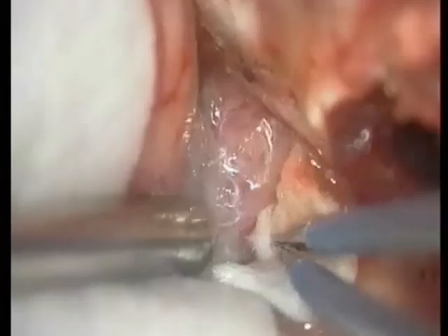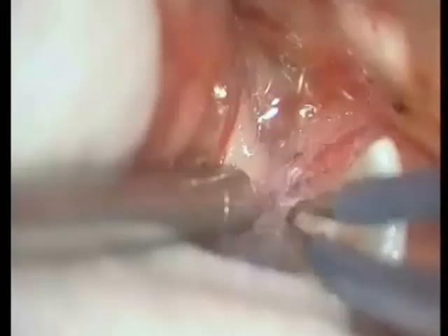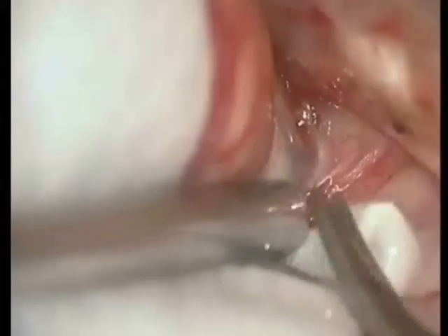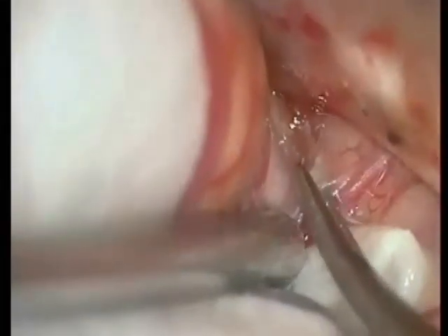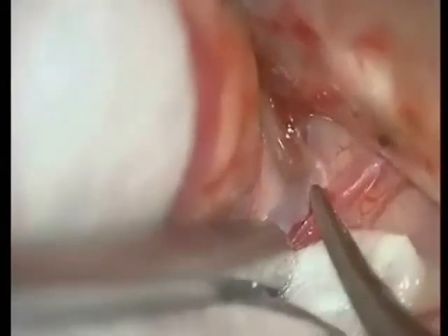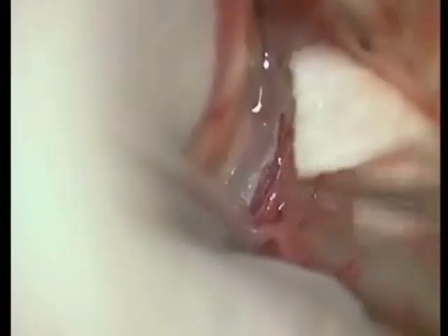Arachnoid covering the sylvian fissure is opened under high magnification, and water dissection is used to expand the dissection plane. The fissure is very tight, so we have to proceed very carefully to preserve all the vascular structures.